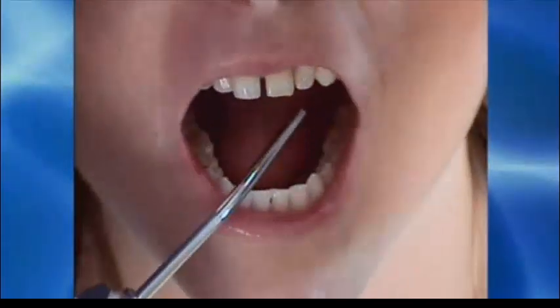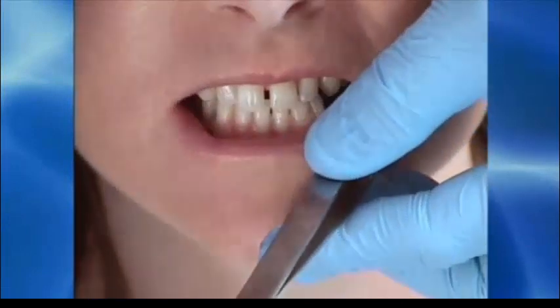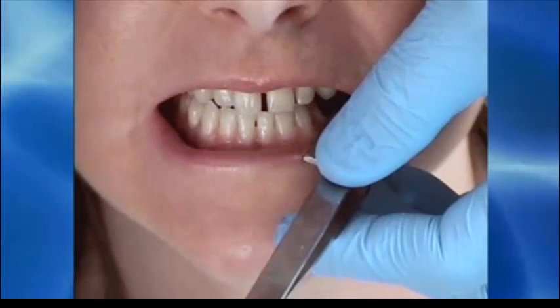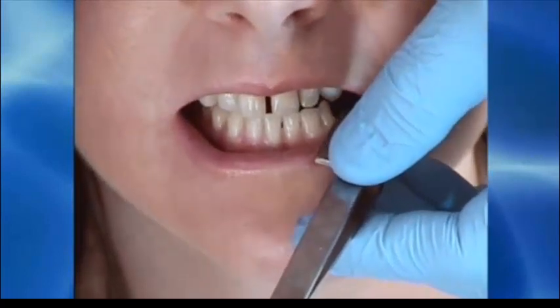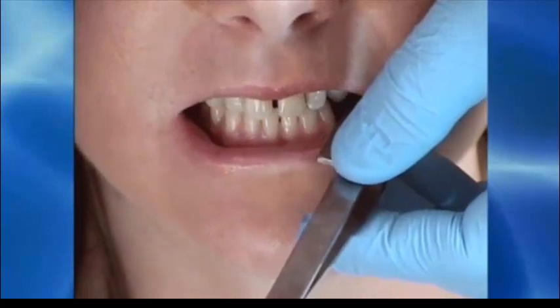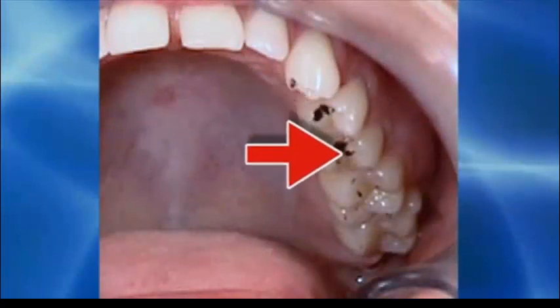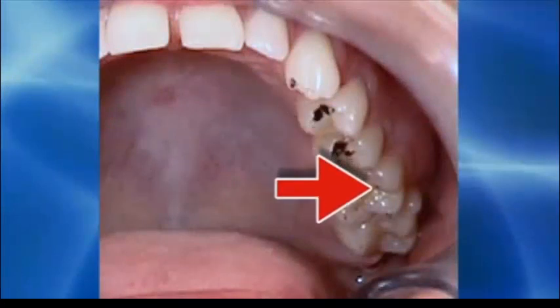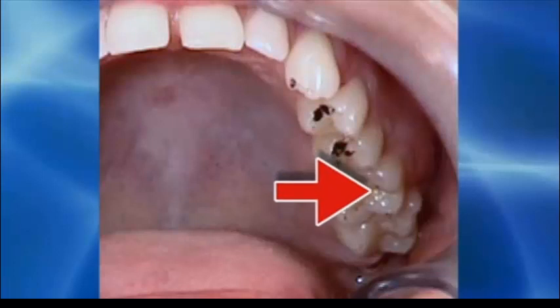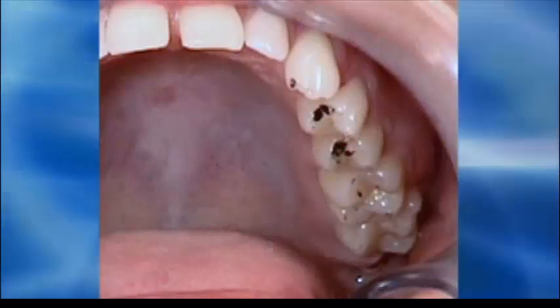To mark the left side, insert the articulating paper after drying the teeth well. Have the patient intercuspate, slide to their right and to their left, back into their intercuspal position, then to the right and to the left again. On the left side, you have working side group function on the two bicuspids and on the first molar, and balancing incline on the second molar.